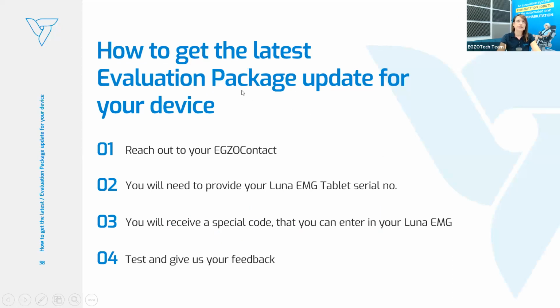And how to get this package update for your device. So I would suggest to contact your EGZOTech, right? So in terms of Asia, it will be Sergi, right? And for Europe, it's Milena. For Czech, it's Anna. For Italy, it's Simone. So you can contact your EGZOTech, and they will need from you your tablet serial number, and will provide you a special code that you will be able to enter in your Luna EMG, and you will get those tests.